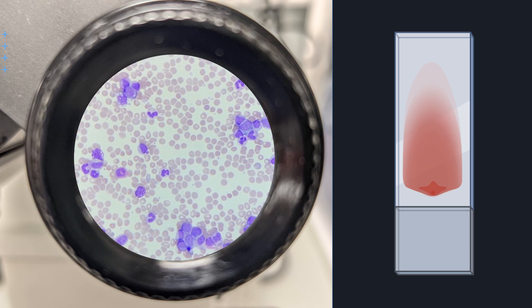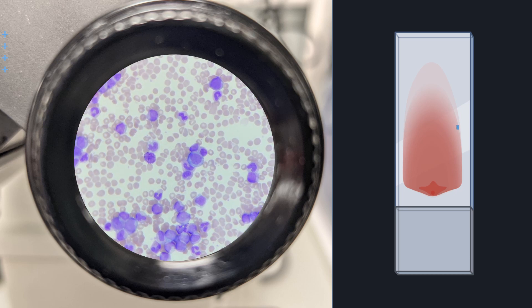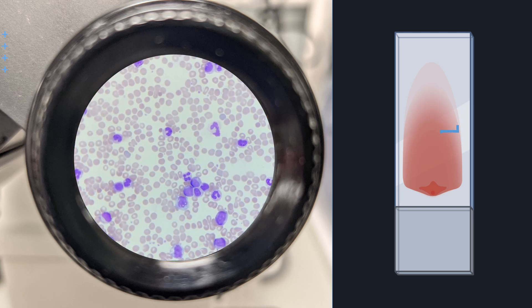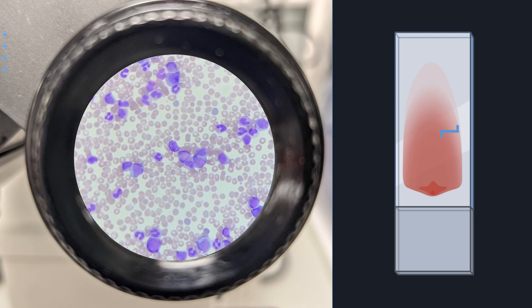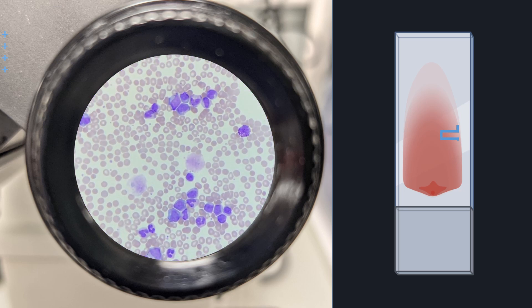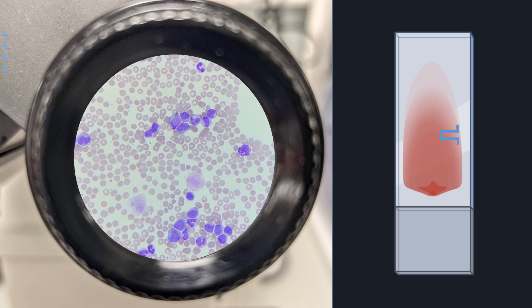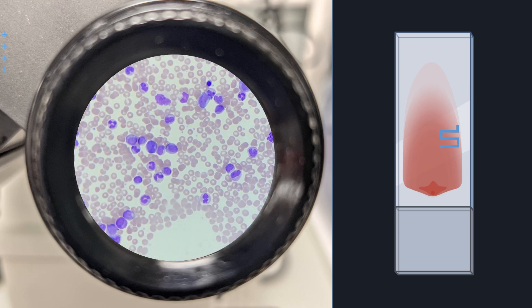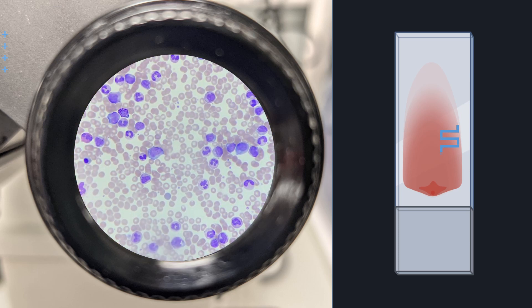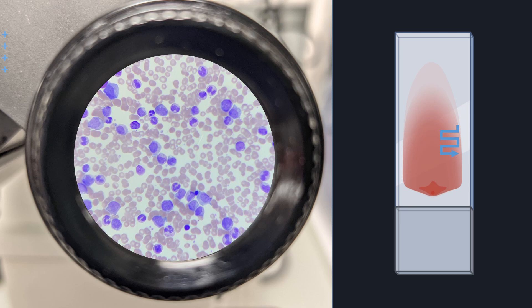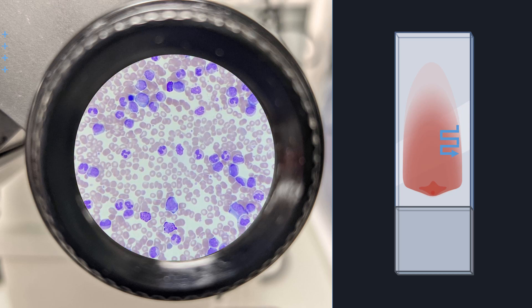A modified battlement method overcomes some of the issues with the distribution of the cells. It is a compromise between the method shown previously and another in which, rather than moving horizontally parallel to the long edge of the slide, we move vertically up and down the line instead. In this modified battlement method, two fields are counted close to the edge of the film, then four perpendicular, and then another two fields parallel to the edge, and so on. Due to the sheer imprecision of the manual differential count caused by the small numbers of cells being counted, maldistribution of the cells would have a very small consequence. If there are aggregates of white cells however, then the inaccuracy would be much higher.